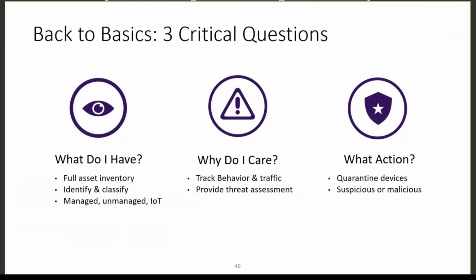So most security programs, and actually there are specific controls written around this as to how to form a security program from scratch, truly begin with understanding what you have. You can't build an effective security risk management strategy before you understand the devices in your environment, the software in your environment, how those things are actually used in support of the business, which devices, software, and assets in general are more important to the business than others, how they should be monitored, et cetera, et cetera.